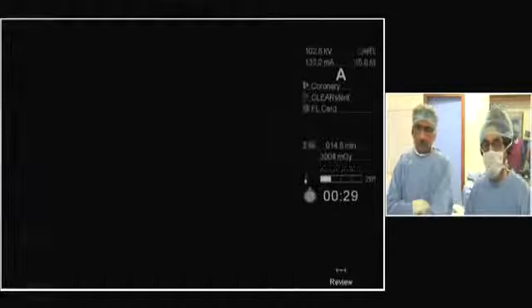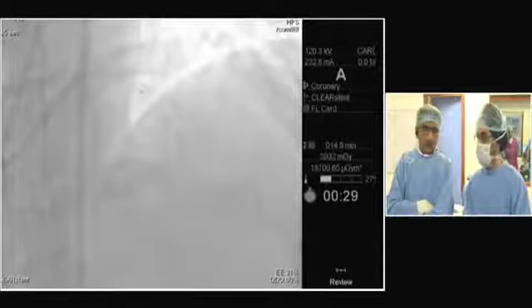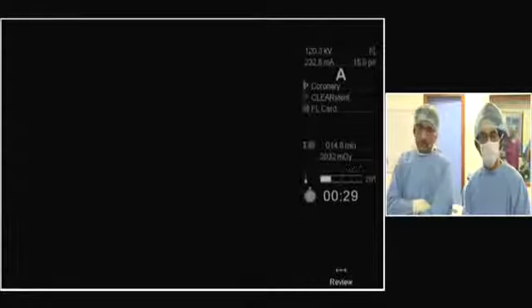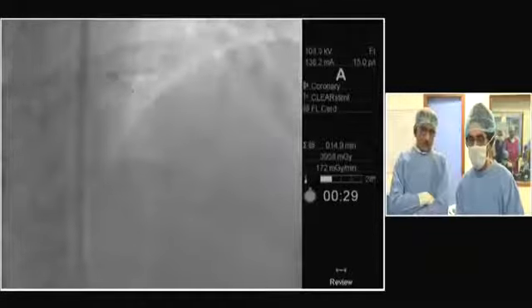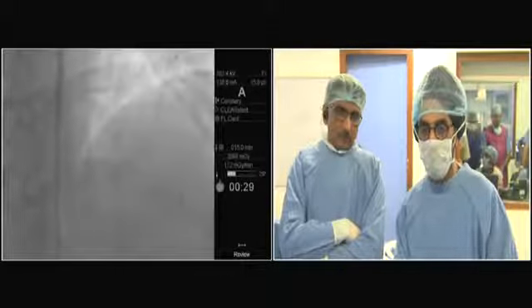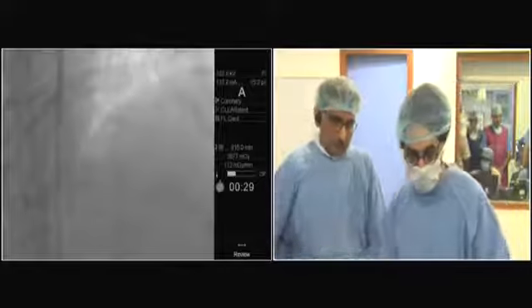I think 8 to 10 is sufficient. Okay, 10. Okay, 10. 12. Okay, down. So we're going to take an IVUS, and I guess it will be a pullback this time because I think I had missed the proximal strut during my post dilatation, so I have to rewire now.